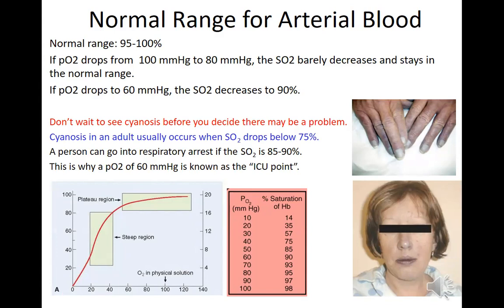Like in lab, and you can do this if you have time today. You can come back if you want. Just do the exercises that we could have done in lab, which is just like walk in place, hold your breath, things like that. Just to see, from moment to moment, how you can measure that on the pulse oximeter, the SpO2, which is peripheral saturation of oxygen and peripheral pulse. And you can note pulse changes, and you can compare this all to an EKG with the changes in heart rate, your tachycardia, bradycardia, stress, exercise stress, along with doing blood pressure.